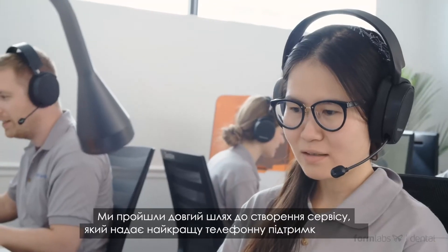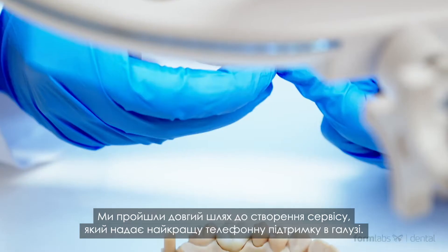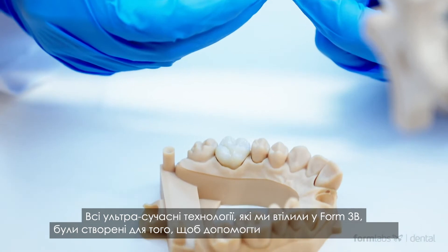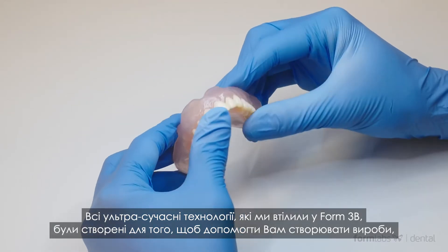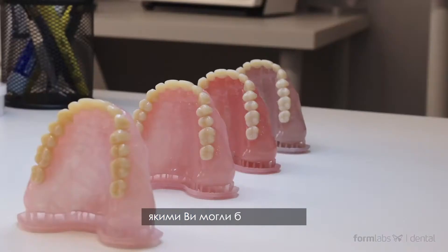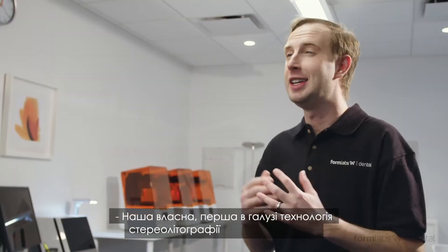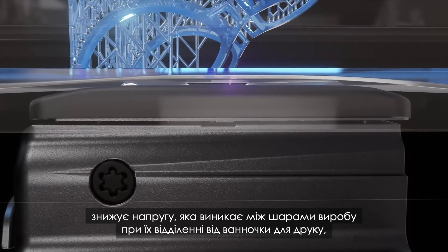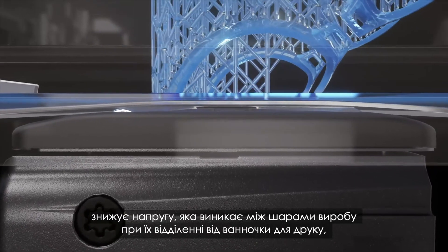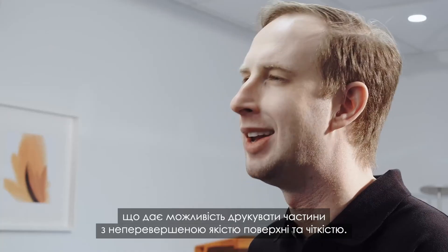We went to great lengths to create a service that provides the best phone support in the industry. All the state-of-the-art technologies we added to the Form 3B were created to help you manufacture parts you can be proud to deliver to your clients. Our proprietary industry-first low-force stereolithography technology reduces the strain created on a part when peeling it from the resin tank between layers, producing parts with incredible surface quality and clarity.